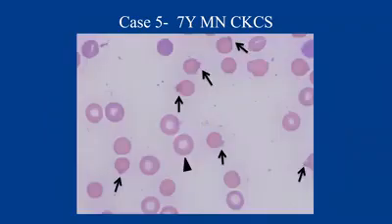All right, other red cell morphologic changes that you may not have noticed. So this right here is, let's say, a typical red blood cell. Technically it has a little bit of artifact going on, but the central pallor is a little too prominent because the cell's punched out. But the cell has central pallor, and this is about the normal size of the red cell. So we're seeing a couple of things.